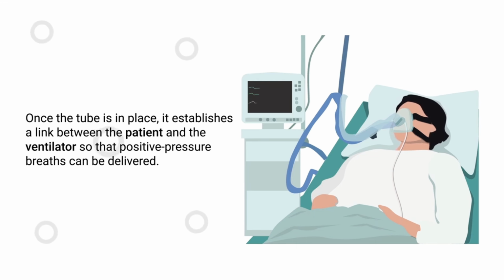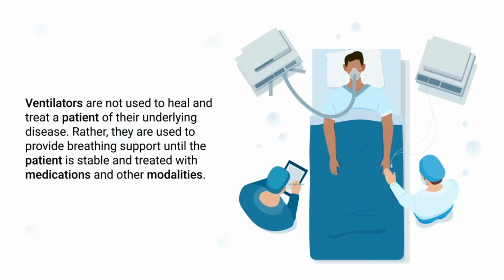And one important thing to remember is that ventilators are not used to heal and treat a patient of their underlying disease. Rather, they are used to provide breathing support until the patient is stable and treated with medications and other modalities.